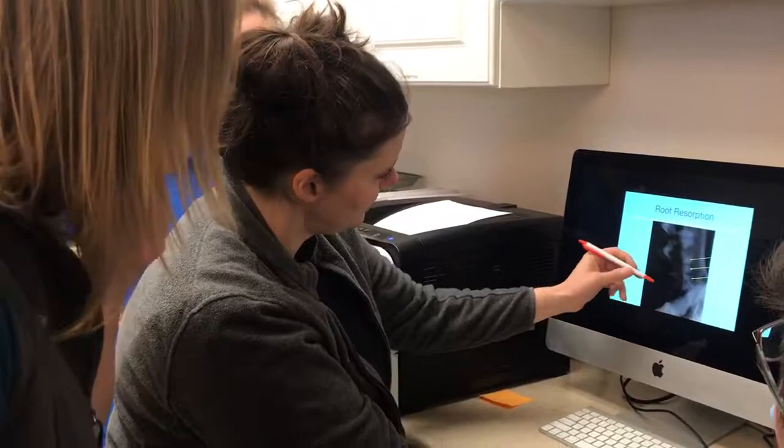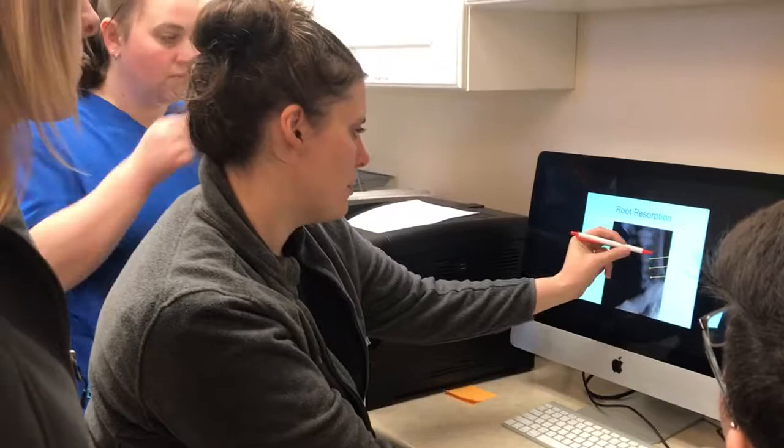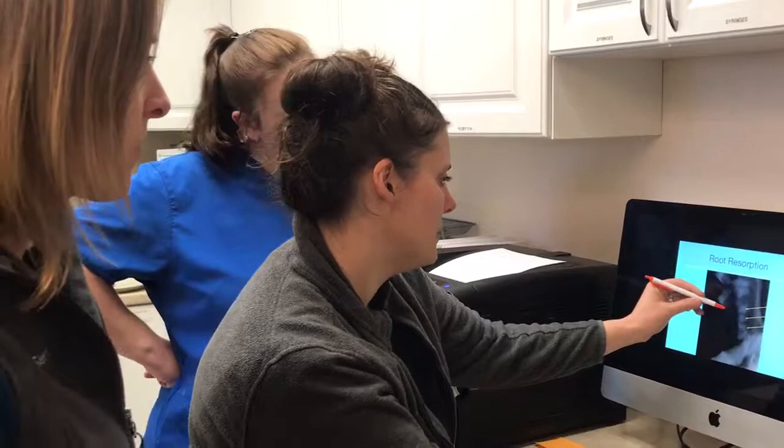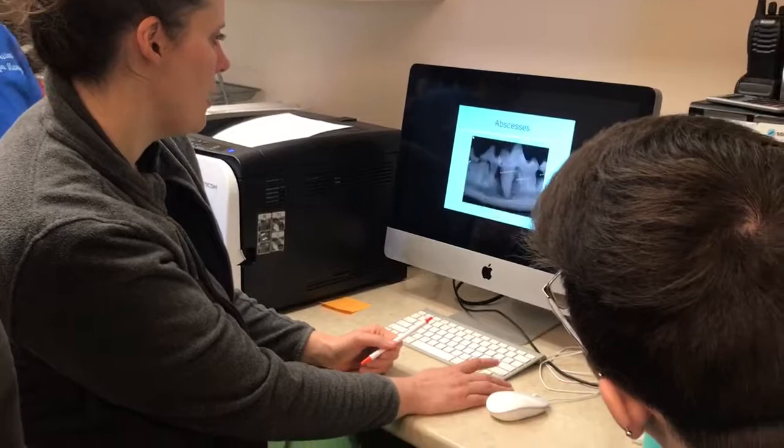This X-ray also shows a tooth where the edge is all lumpy and bumpy and you can't see the pulp cavity anymore. The bone all through here has a kind of Swiss cheese effect. This crown is only hanging on by a little thread, although this X-ray is pretty dark so there could be more attachment. This X-ray needs to be taken again at a lighter KVP.